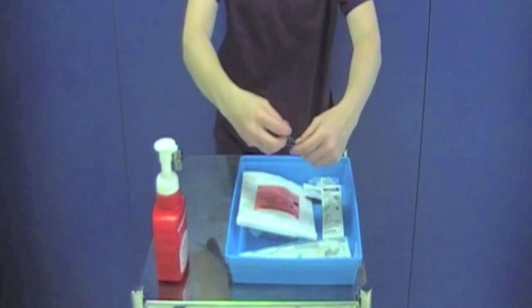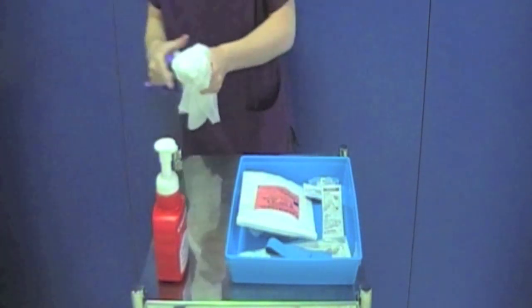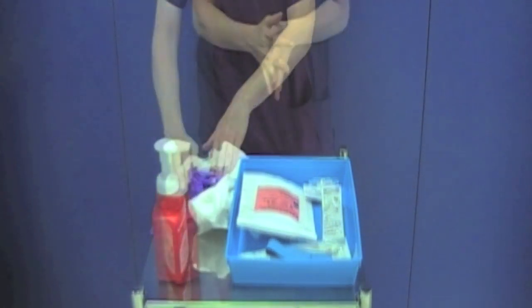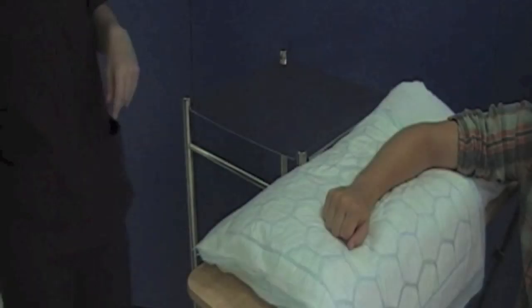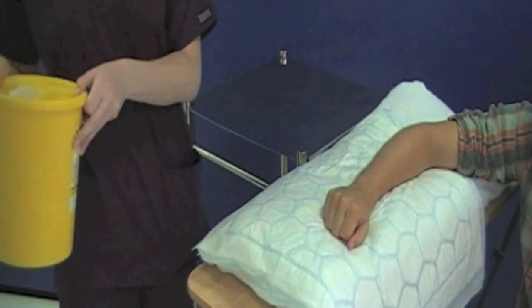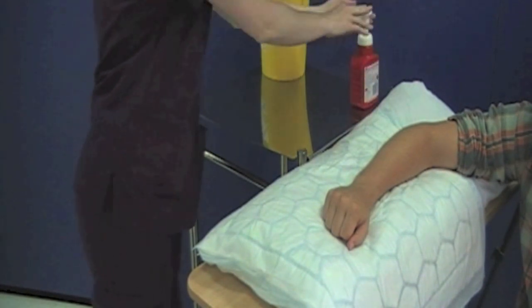Place your apron and gloves onto the clean trolley. You should now decontaminate your hands and proceed directly to your patient. Once you're at the patient's side, make sure your equipment and sharps bin are within easy reach and decontaminate your hands.